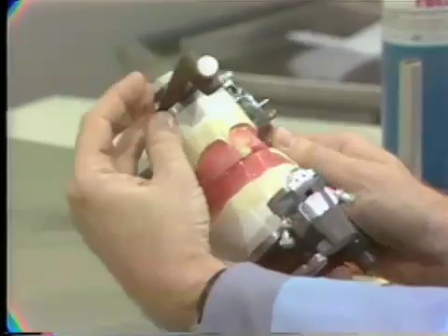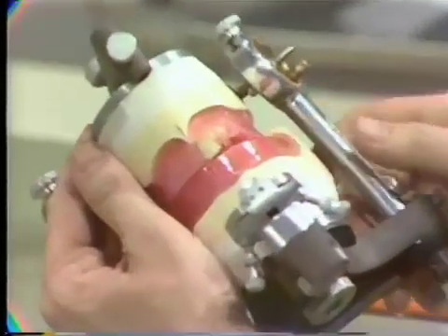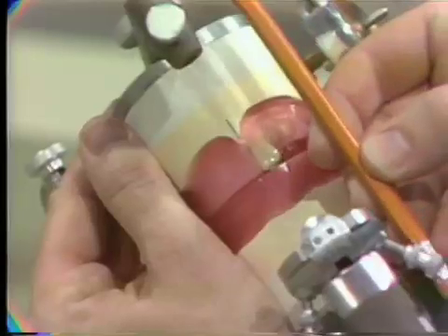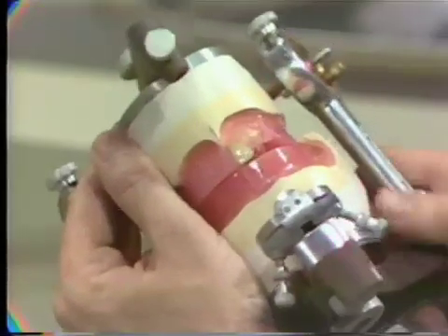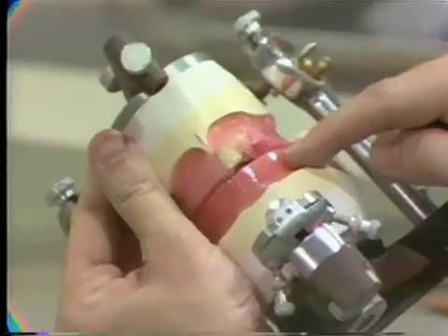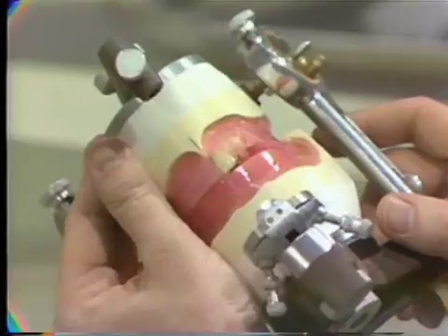Now at this time, in its initial setting, I've made a couple of errors. One is that the tooth is not in the proper axial direction, you see. It is leaning toward the distal. The incisor is leaning toward the distal. The 1 millimeter below the plane of occlusion, and we will use the lower plane as the plane of occlusion throughout the tooth setting. I am about 1 millimeter below, so that is correct.